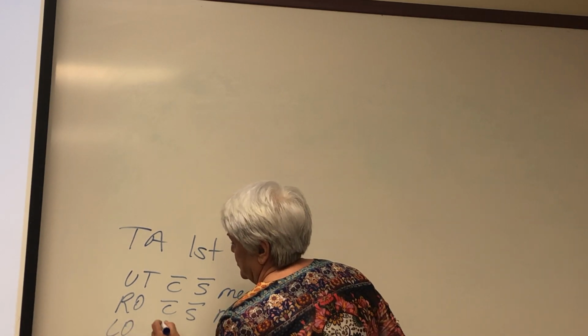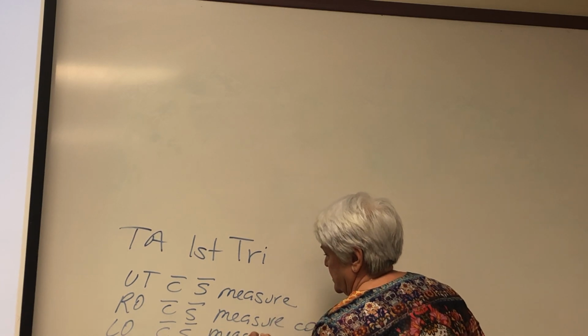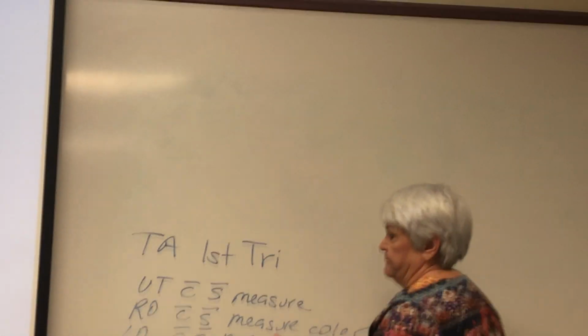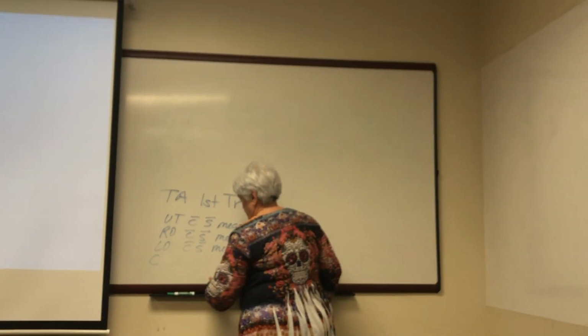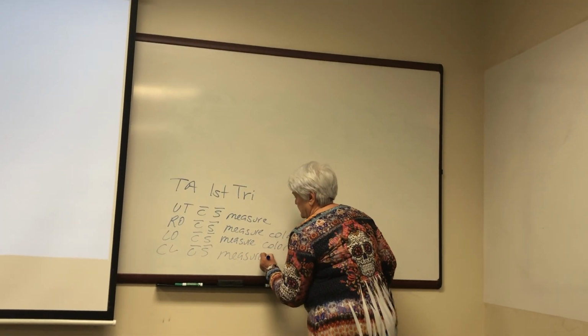Left ovary with, without measure and color. Corpus luteum with, without measure and color.